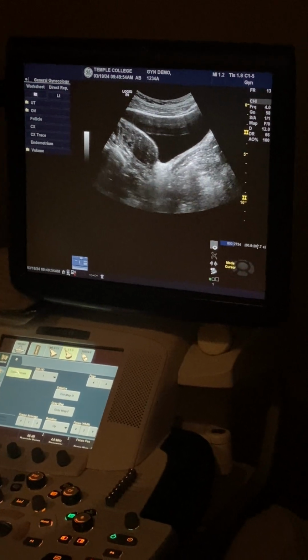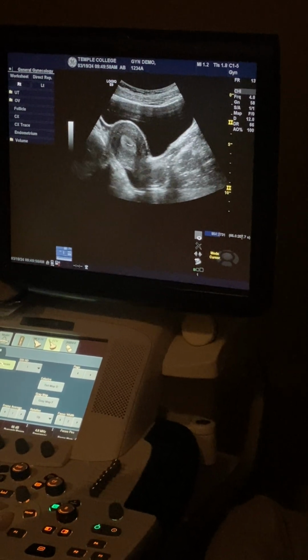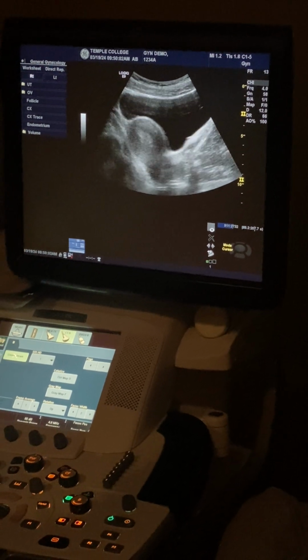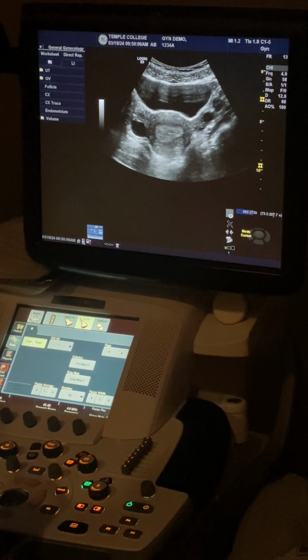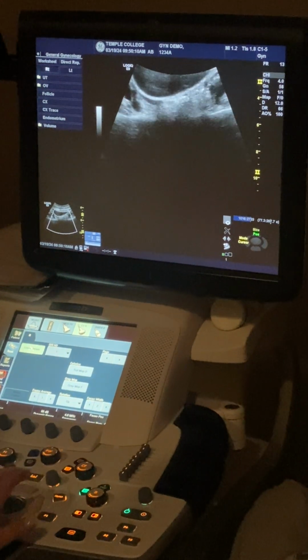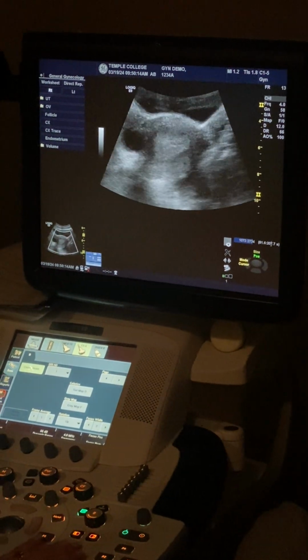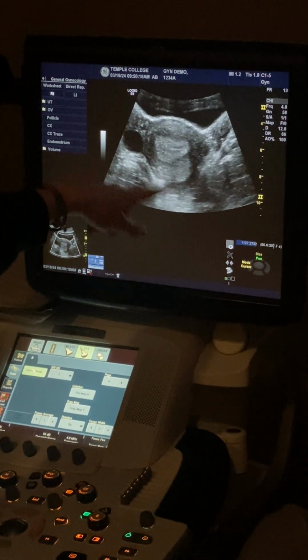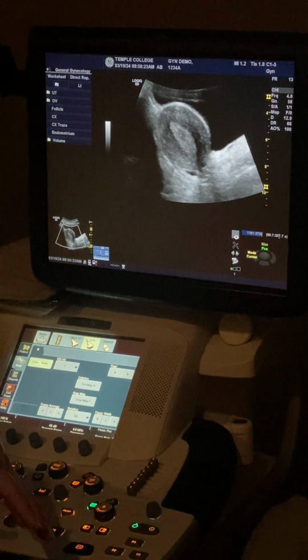So again, all the way to the right, give me this one, a good midline for measurement, a little bit left, all the way left. That's your sweep images. In trans, see, now, Alyssa, this is what you were asking about, transverse endometrium, right? She has the 3 lines right now at the stage that she's at, so you can see that. What I'm gonna have to do, to see how thicker it looks when I come from this direction than it does when I'm here, and it's even.